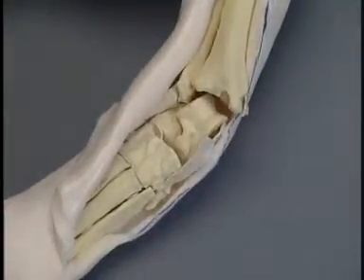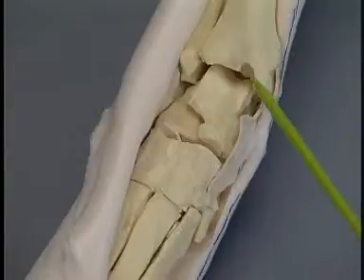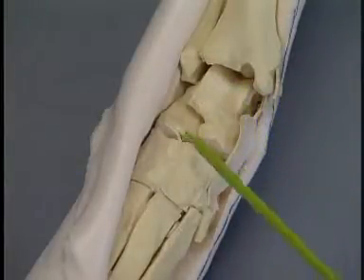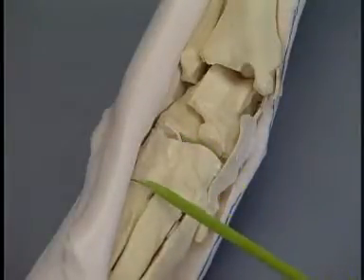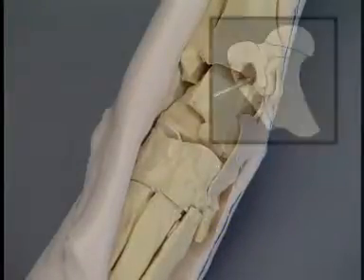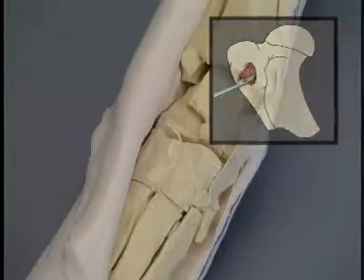In the clinical case, the articular cartilage of the talocrural joint surfaces, the proximal intertarsal joint surfaces, and the tarso-metatarsal joint surfaces are thoroughly removed with a bone curette or high-speed burr following the contours of the bone ends. Cancellous bone is harvested from a suitable site. The graft is placed within the prepared joints, and additional graft may be added after the plate is secured.